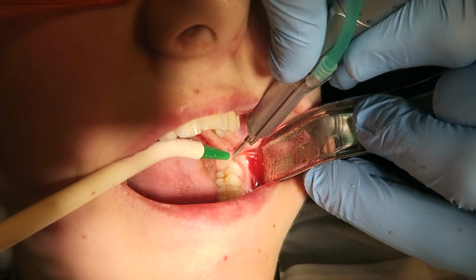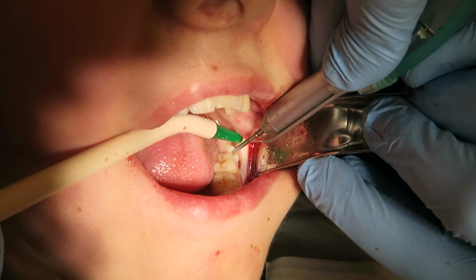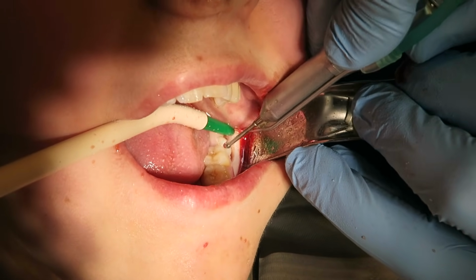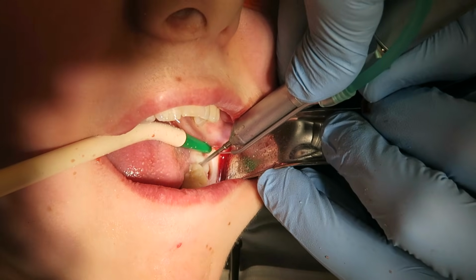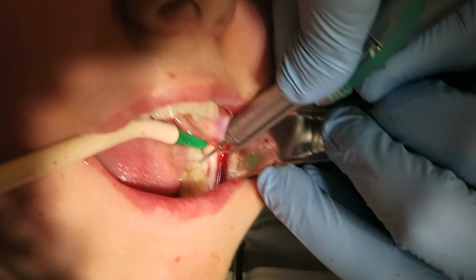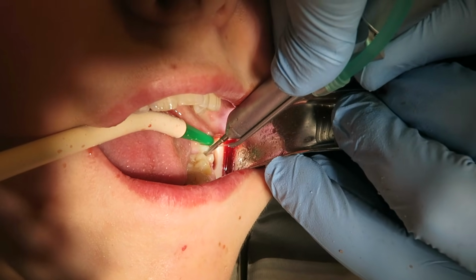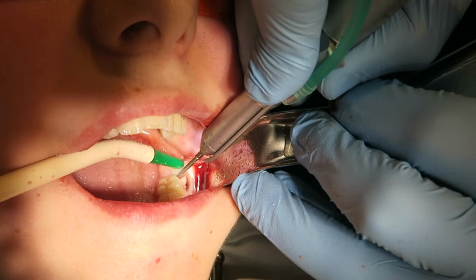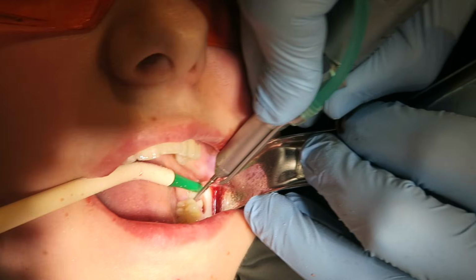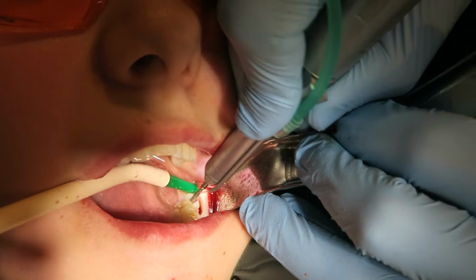Make sure you cut to the correct depth. My aim is again to go down to the cemento-enamel junction so I can see it. I see where the bifurcation is, and as you can see now, I'm dividing the tooth longitudinally to section the roots. The other advantage of using the round burr is you can see where the tip is all the time. This makes it slightly safer than using the fissure burr.